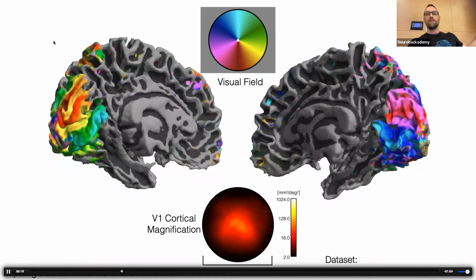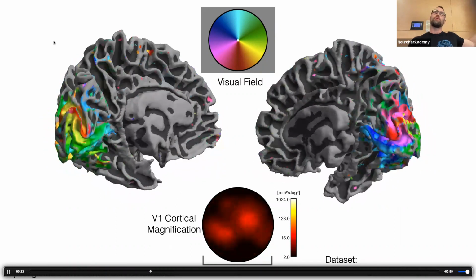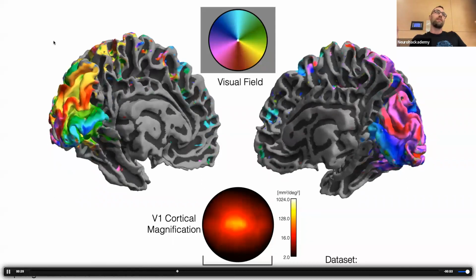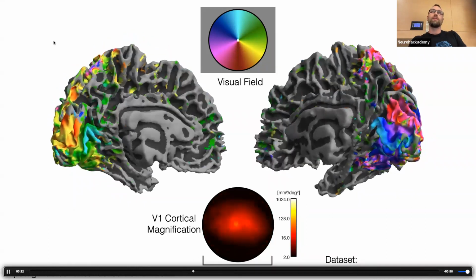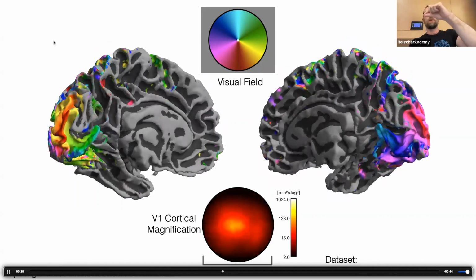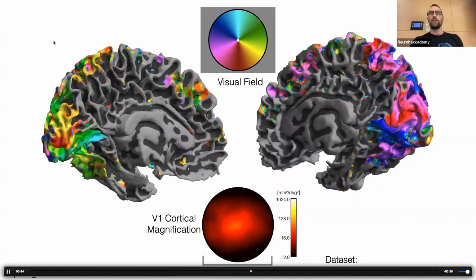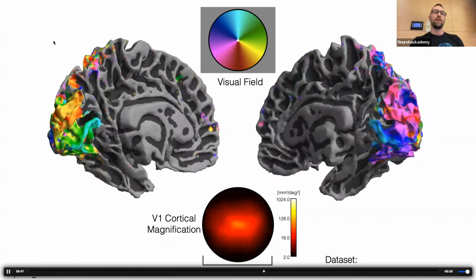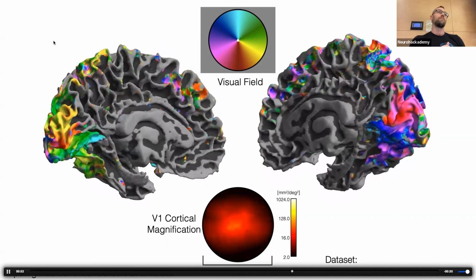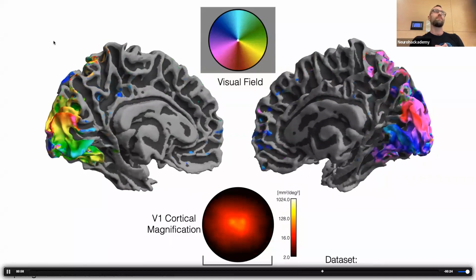But the reason I'm showing it today is because making this is not really possible without FreeSurfer, and the tools that have come since. Every time one of these brains morphs into a different brain, I've got to figure out, for every point on that first brain's cortical surface, where it's going to end up in the second cortical surface. In order to do that, I have to have some correspondence of the points between the two brains. If I just give you a brain, you don't have any idea what that correspondence is like. You can maybe guess, but you need some automated way to make those. Does that problem generally make sense to people? Why that's a problem?